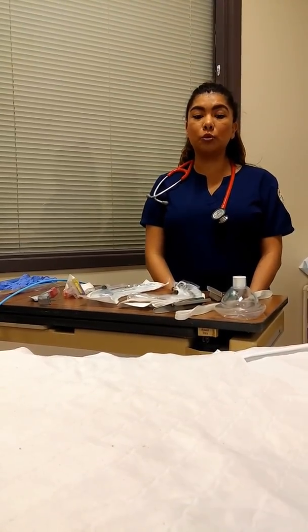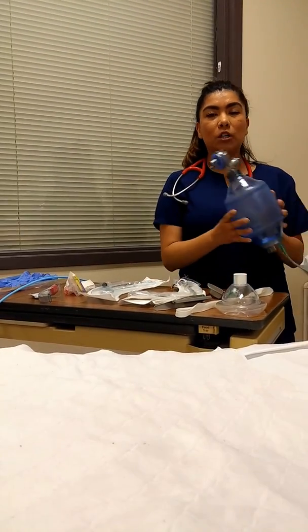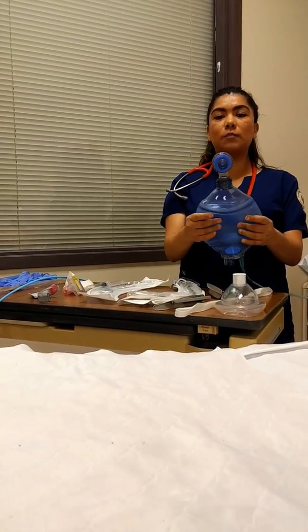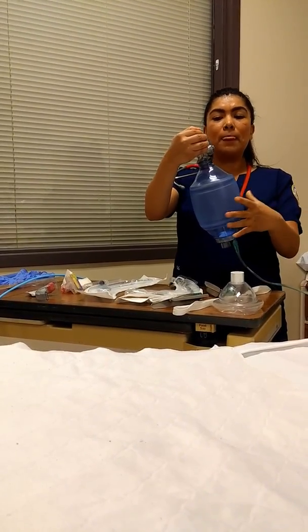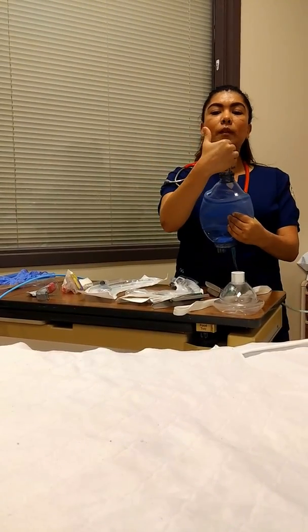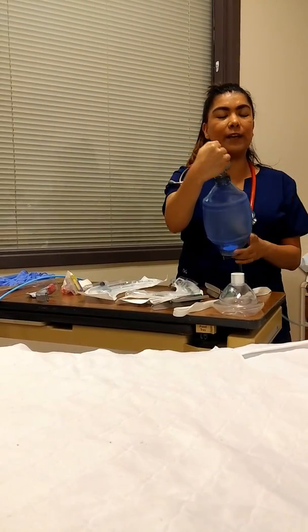Okay, so we want to go ahead and gather our equipment prior to entering the room. We want to make sure that we have a properly functioning ambu bag. The way to check it is we look at the duck valves and make sure that they open and close. We go ahead and occlude the opening. We want to make sure it does not deflate. Then we're going to open it up, occlude the opening again, and make sure that it re-inflates.